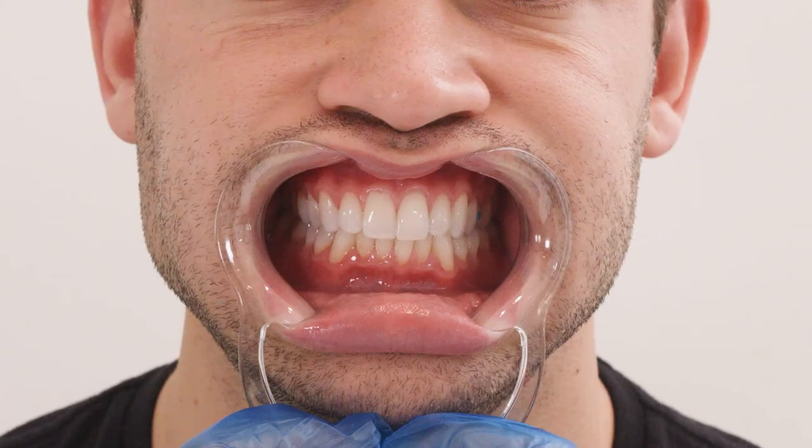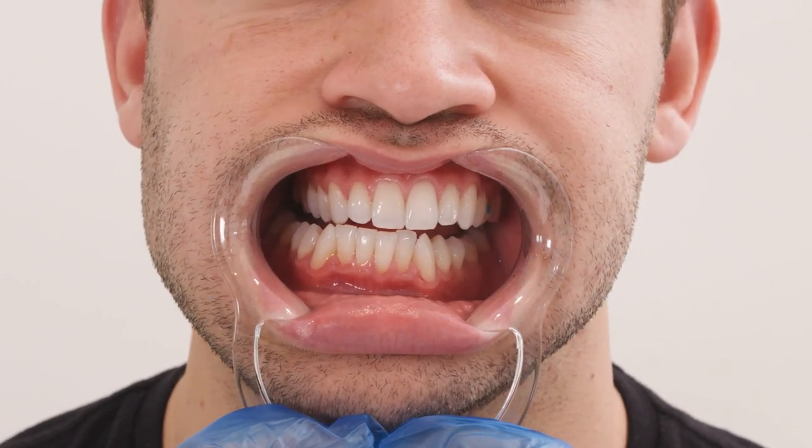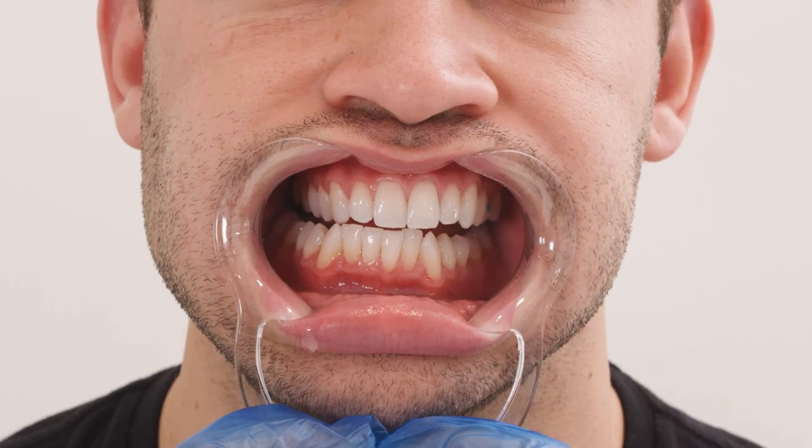The last two are your left and right bites. Bite down naturally on your back teeth — this is your natural bite. Make sure the photos clearly capture your back teeth. Photos that have gaps between your teeth, or with the jaw askew, will have to be retaken.